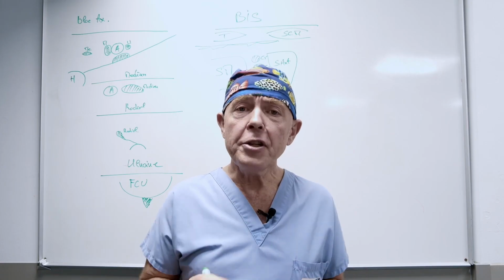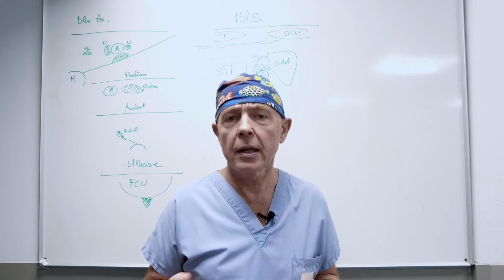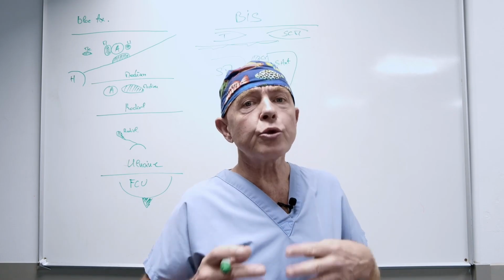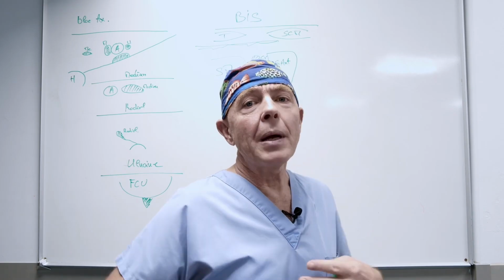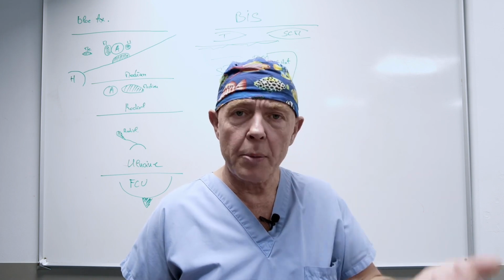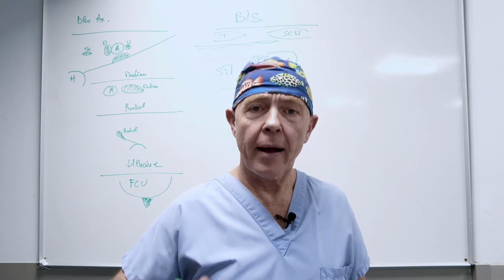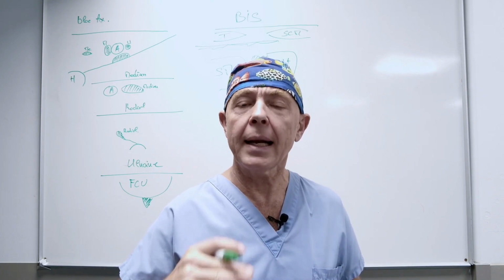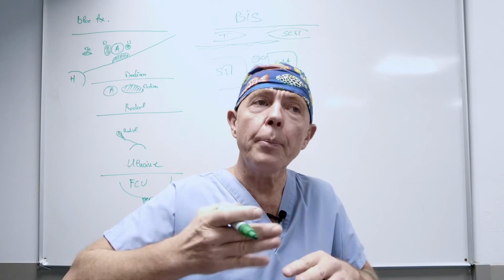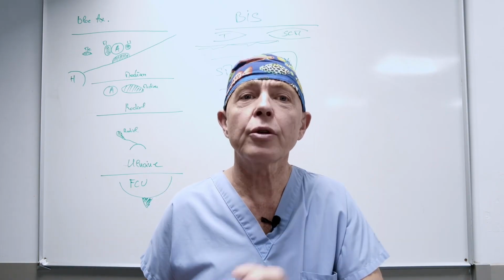To wrap up our discussion on upper extremity blocks, we have the supraclavicular block. I approach it in a truncular manner, somewhat similar to a Bisbes method. You have additional descriptions, which I've incorporated in the book and in the posters, using the traditional form, with the probe positioned truly parallel to the clavicle. However, here I will demonstrate it to you with a slight angle. It will be more of a bis-bas approach, utilizing the truncular method.